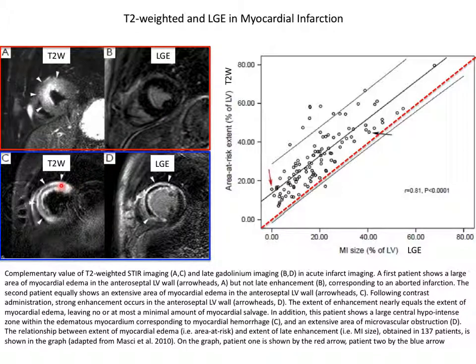On the other hand, on this T2 weighting, we see there's very bright T2 on this lesion in this patient. There's a central core that is dark, which likely means there's some kind of iron deposition or something causing the T2 to get really short in the center of this. Remember, this doesn't involve contrast agent. This is just natural T2 values in the tissue.